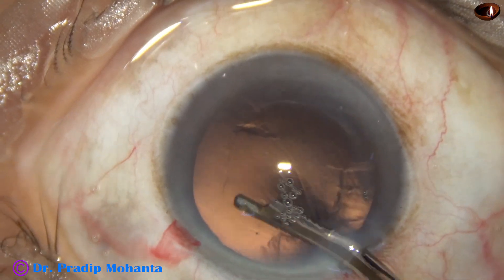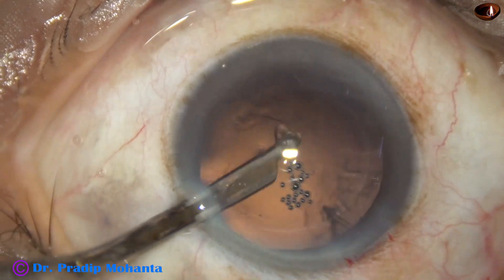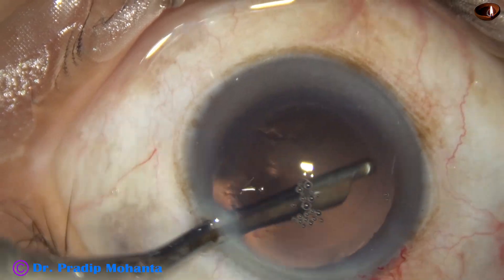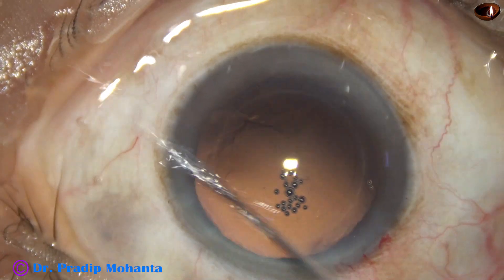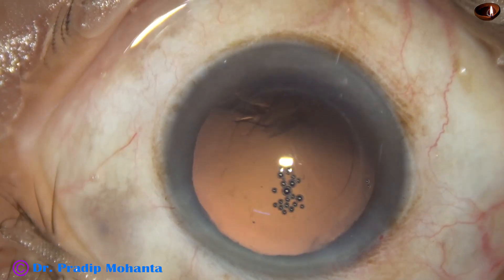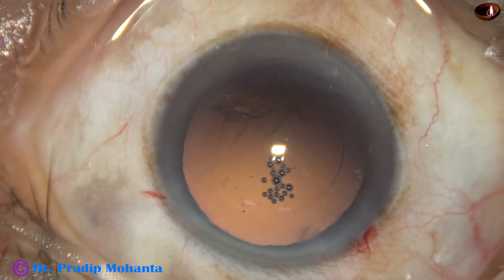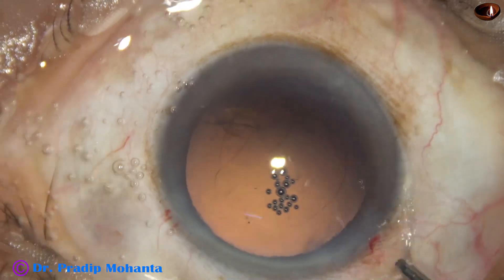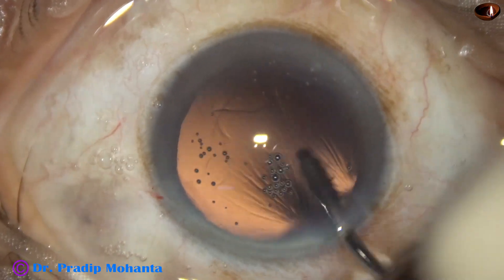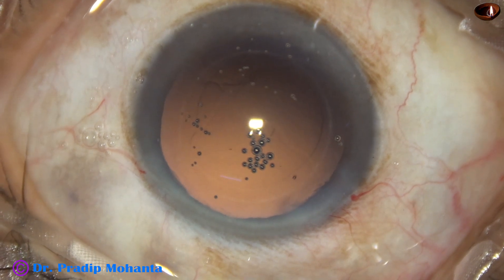The advantage of Simcoe is that it keeps more control, is safer, and an SICS surgeon is used to this instrument, so they do not have to take the challenge of bimanual irrigation-aspiration. But in course of time we have to learn bimanual irrigation-aspiration. Here the irrigating probe of bimanual IA is being used to polish the posterior capsule; the aspirating probe is not used.